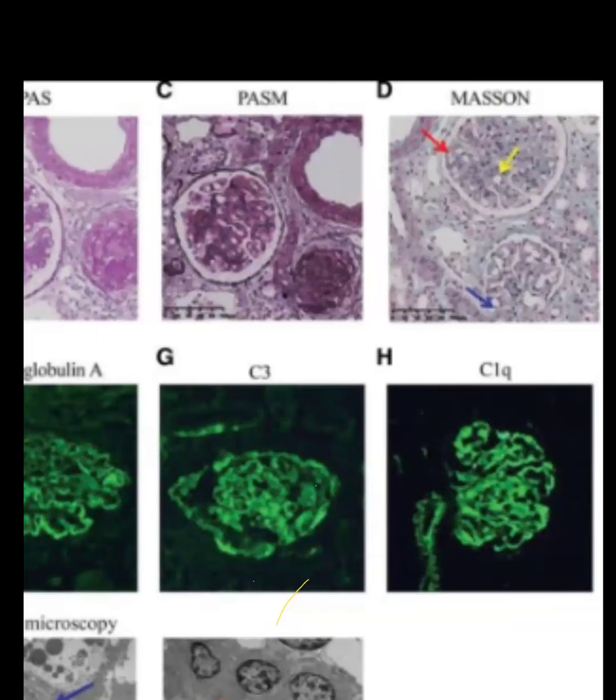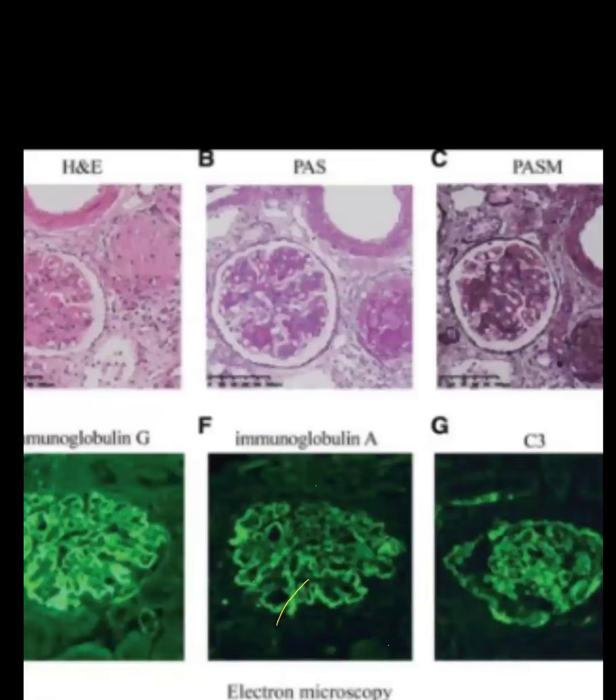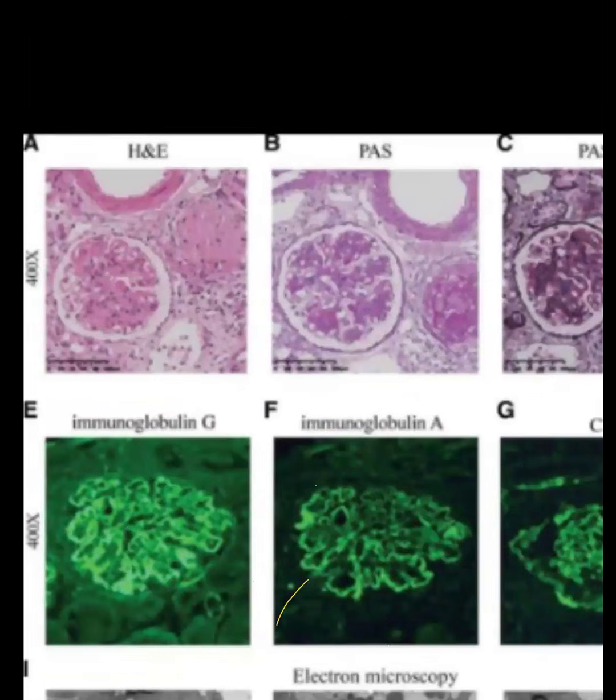We can see the different structures. In hematoxylin stain, the nuclei appear blue or purple, and eosin is for the cytoplasm or the protein, which looks pink. So there are actually two dyes being used here. One dye is for the cytoplasm, and the other is highlighting the nuclei.